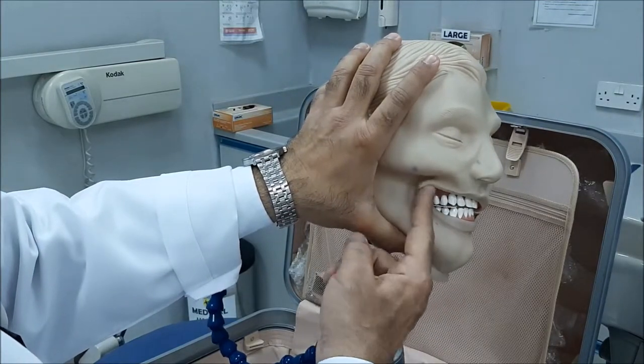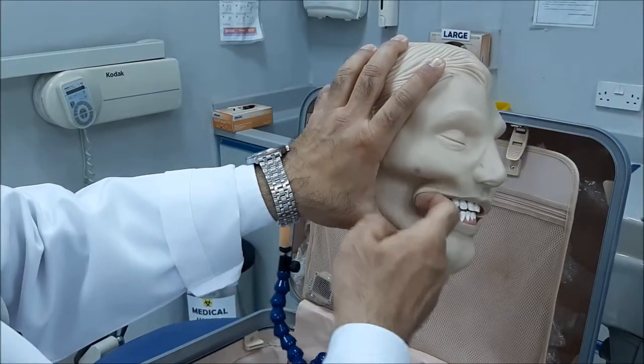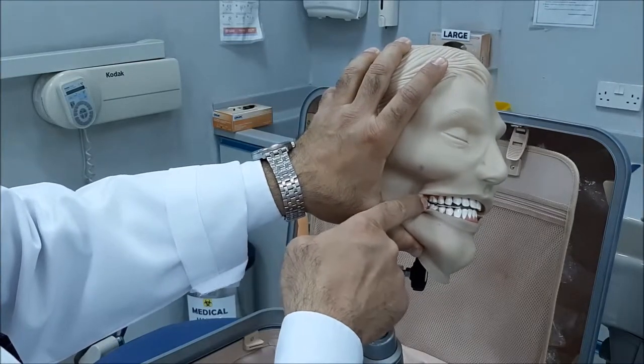From the canine backwards to the mesial of the six.